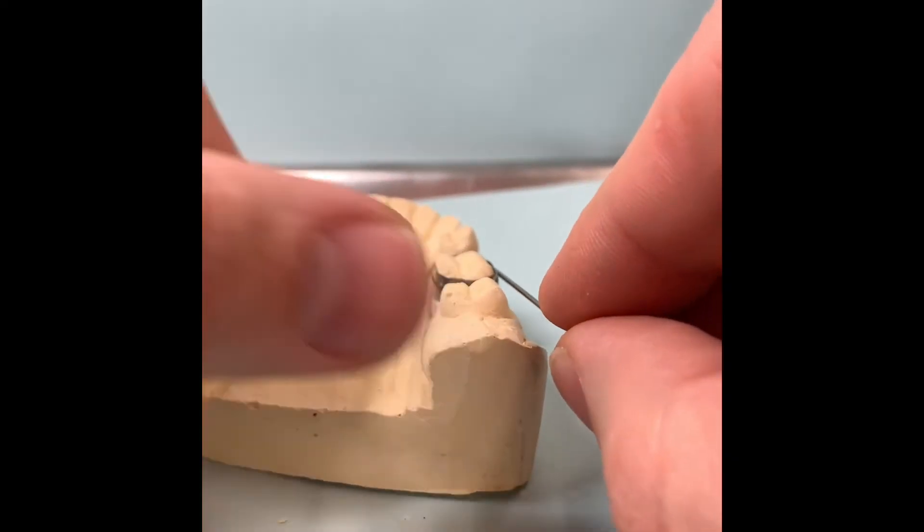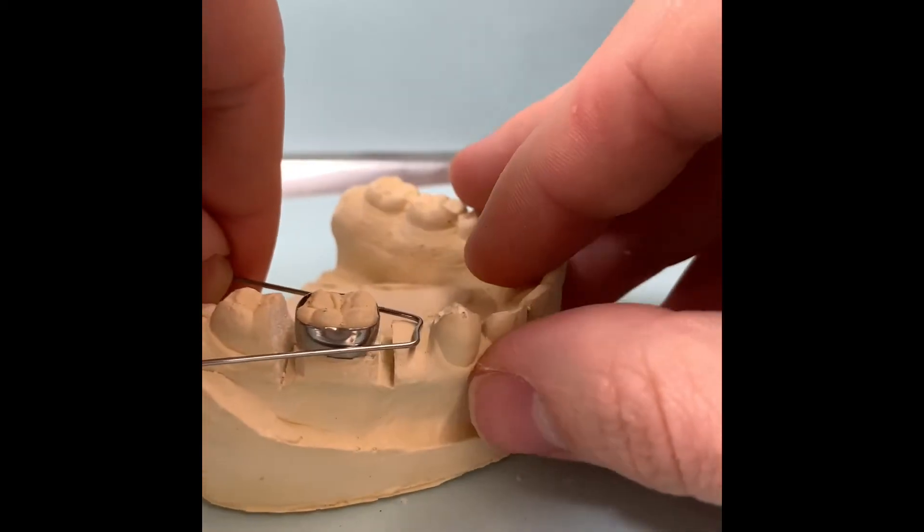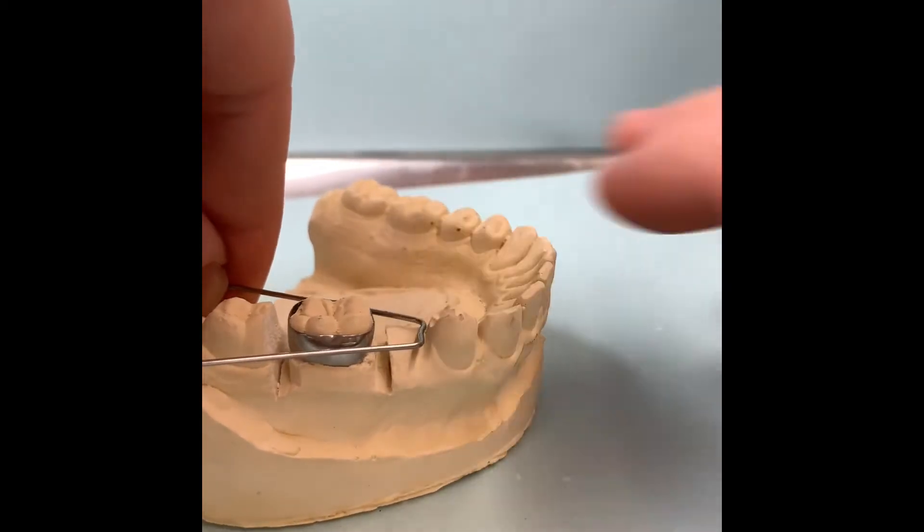Once again, check to make sure that it is fitting. And now you see how it's straight.